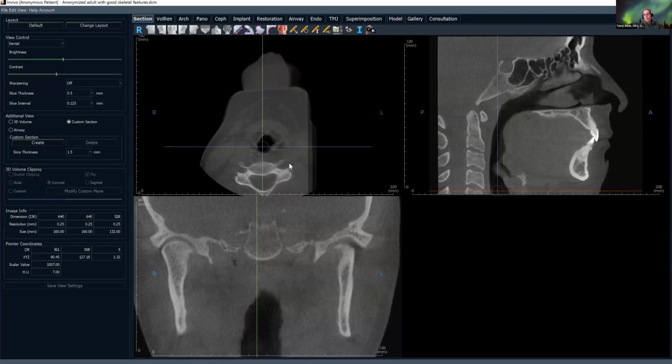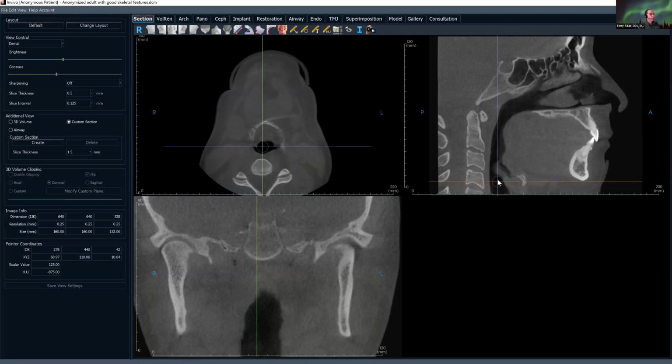In fact, just yesterday, I found a fairly enlarged transverse foramina on the left side, and I shared it with my study club, and we had a discussion: how common is that as an anatomic variant, or is there a neural or vascular tumor there? I don't know. I identified it. I put it in a report and made a note to the doctor that the patient should share this finding with his physician. They can decide. I don't really know, but it was notable enough. So you do want to look at these foramina because occasionally I've actually seen a fair amount of these.